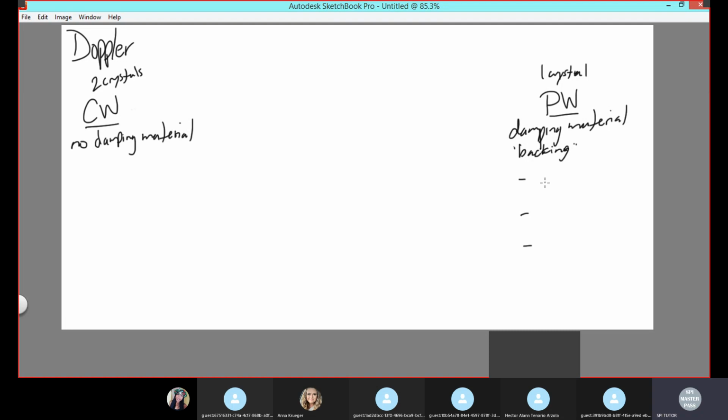So if you have a backing material, you have a wide bandwidth, which means many frequencies. You also have a decreased sensitivity, and you have a low quality or Q factor.